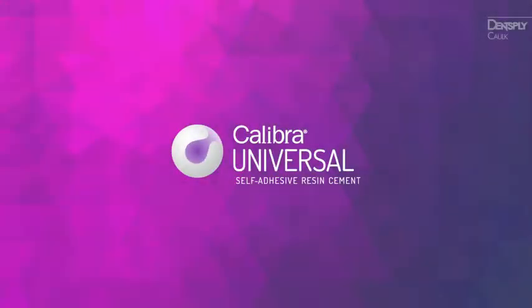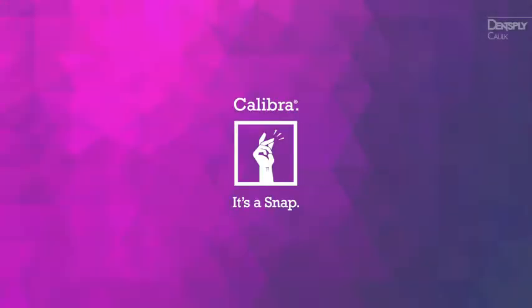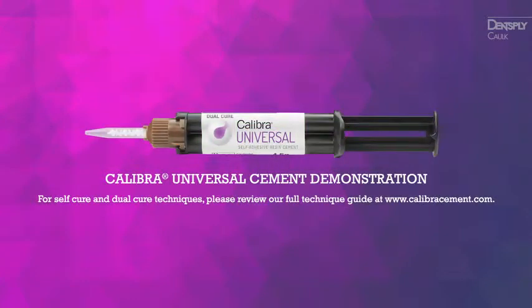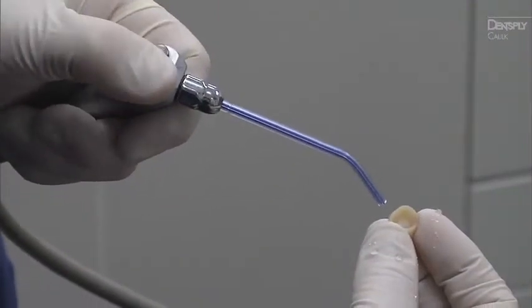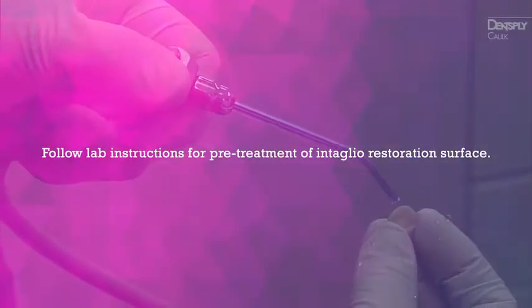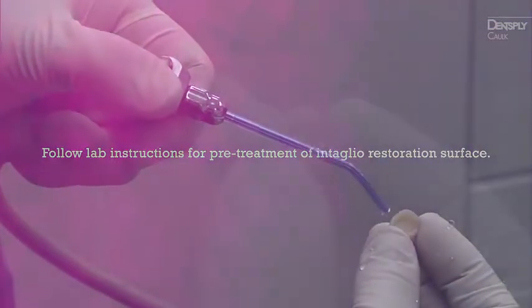With Calibra Universal Cement, excess cleanup is now a snap. To start, clean and dry the restoration. Discard a small amount of material and attach the mixing tip.